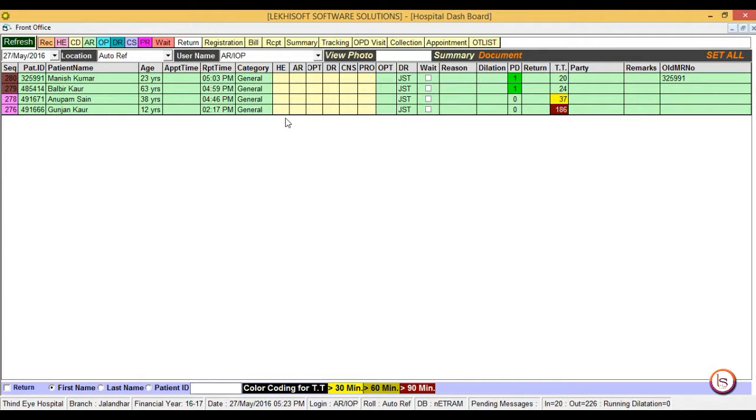Select the patient who is being displayed downwards in the list first. Now double click on the AR column as it represents the auto refraction column.